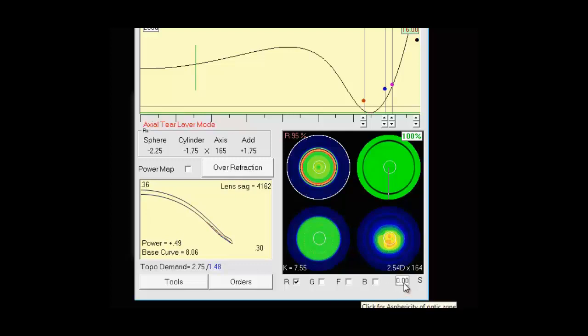And finally, we have this drop-down box with the S next to it for shape factor. And that will allow us to create a back aspheric optic zone. If that's set to zero, which is the default, we have an aspheric periphery to the lens for a spherical optic zone.